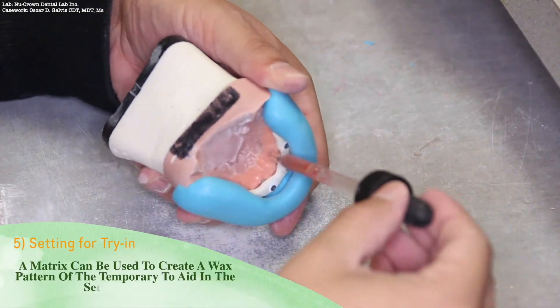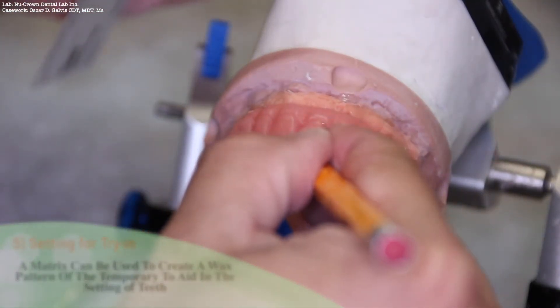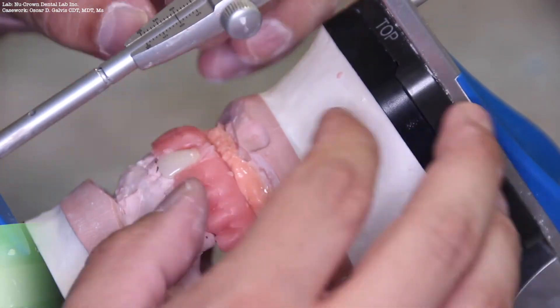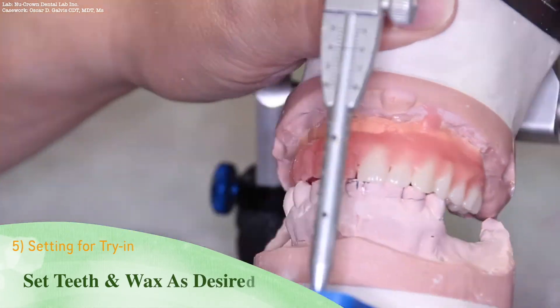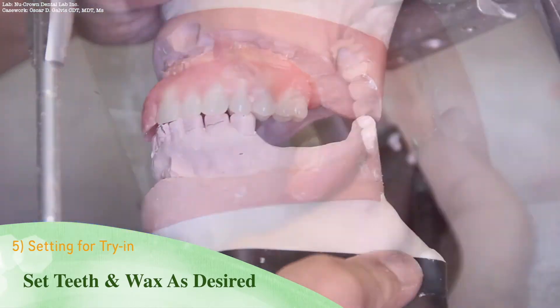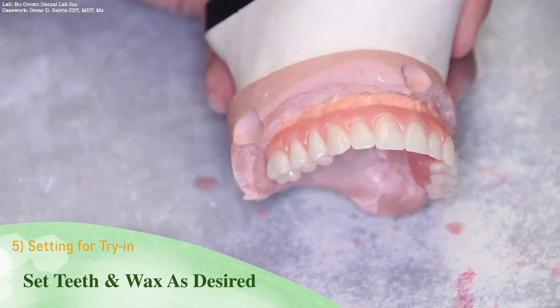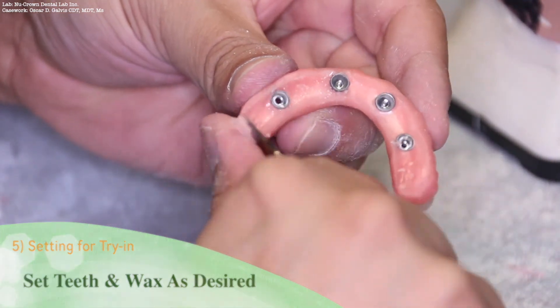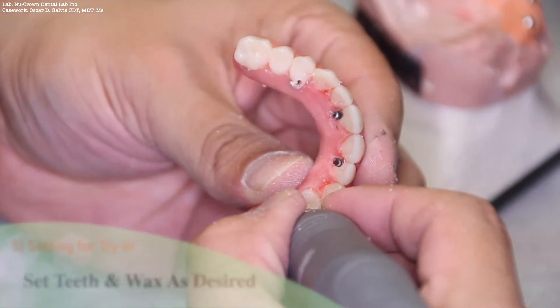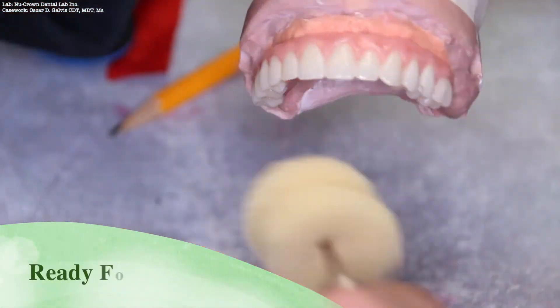Next, using the matrix, you can create a wax pattern of the temporary restoration to aid in the setting of teeth, or even to use as a plug-in for the denture teeth of a previous setup. At this time, you may set teeth and wax as desired. The case is now ready for Trilor.